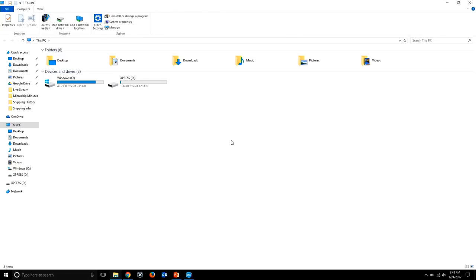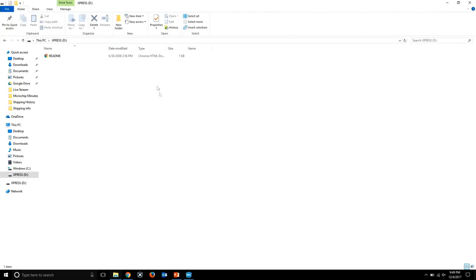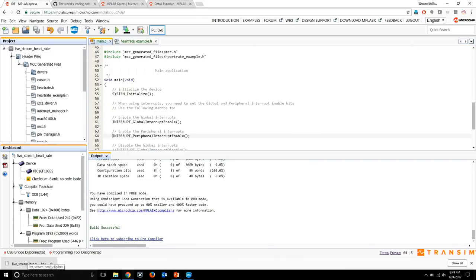We're in. All right. If you go back to your computer screen, you can see the Xpress board showed up as a mass storage device, like a flash drive. You can actually open that up, and in the flash drive there's a README file that will take you to a different web page. Now, in my download folder, I can see the heart rate project that we did. It created, compiled, and downloaded a hex file, the compiled file. I'm just going to.